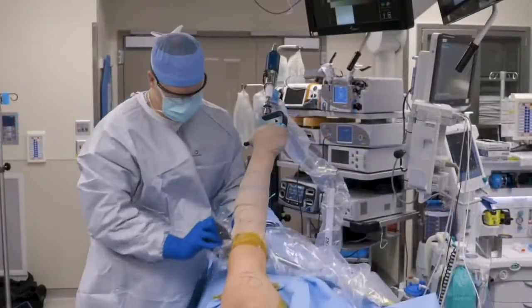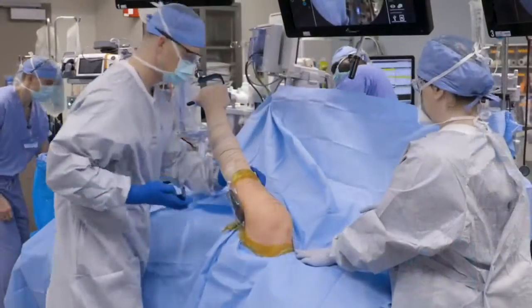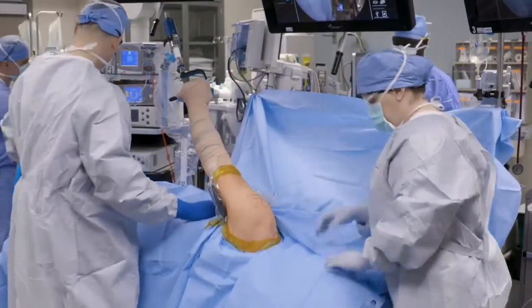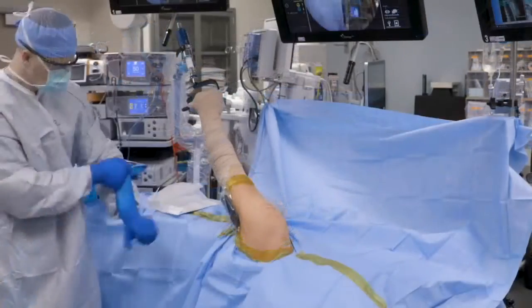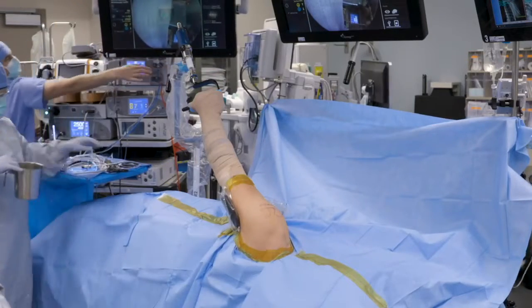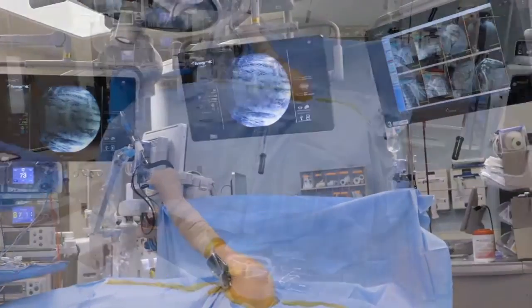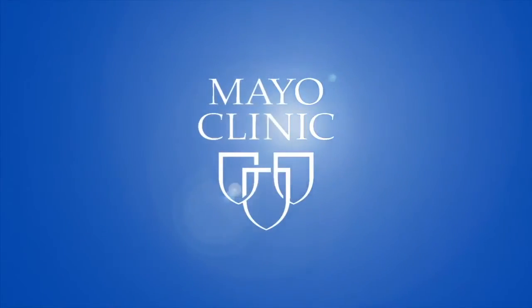The arm bolster is then brought into place to provide a laterally directed force on the humerus, which increases the glenohumeral joint space. An additional drape can be used with a split cut in it to wrap around the arm bolster, secured using small strips of ioban. This helps provide additional protection of the sterile field and keeps fluid from invading the space of the anesthesiologist. Anyone participating in draping then changes their gloves. The petals are appropriately positioned, as are the arthroscopy screens and the patient's images, for optimal access and visualization during the case. Here is a view of the final setup. This concludes our lateral decubitus positioning and setup. Thank you for your time and attention.